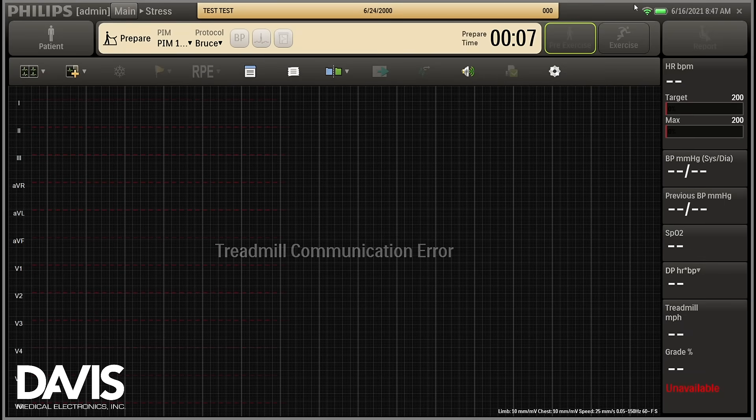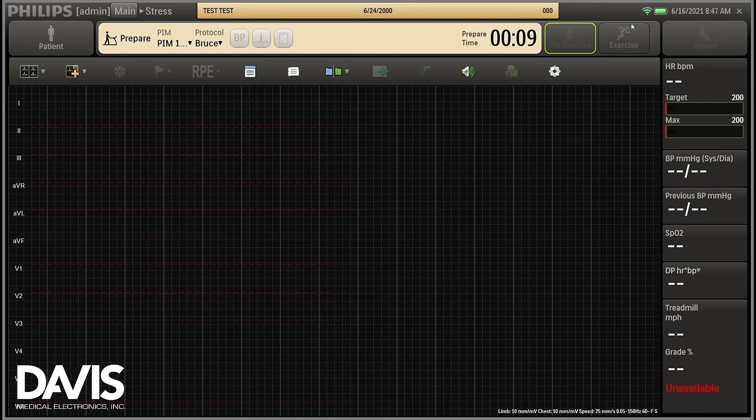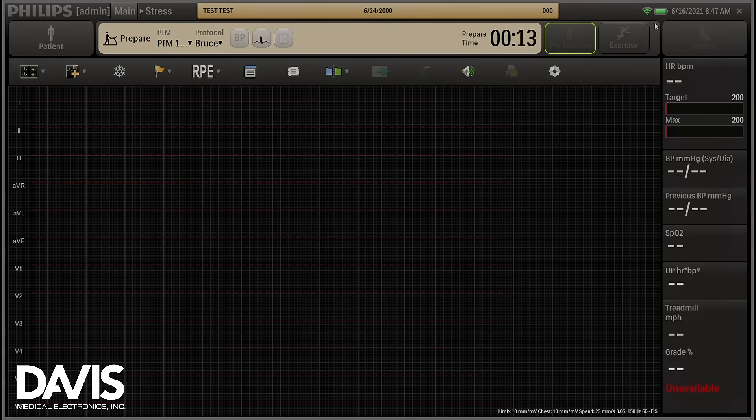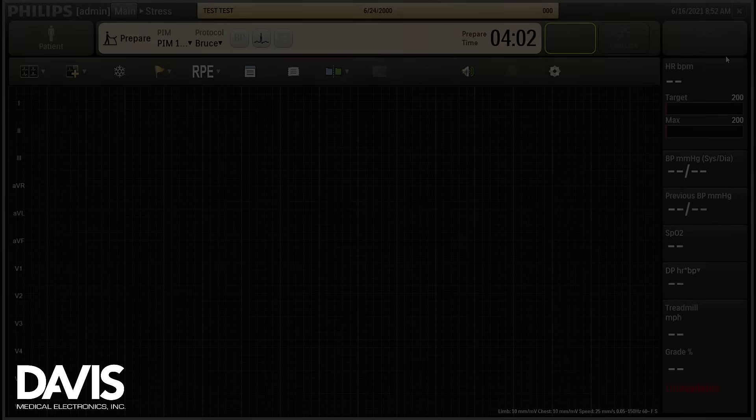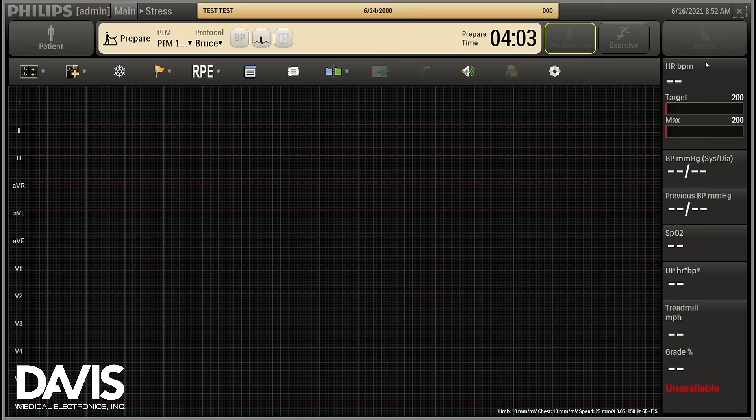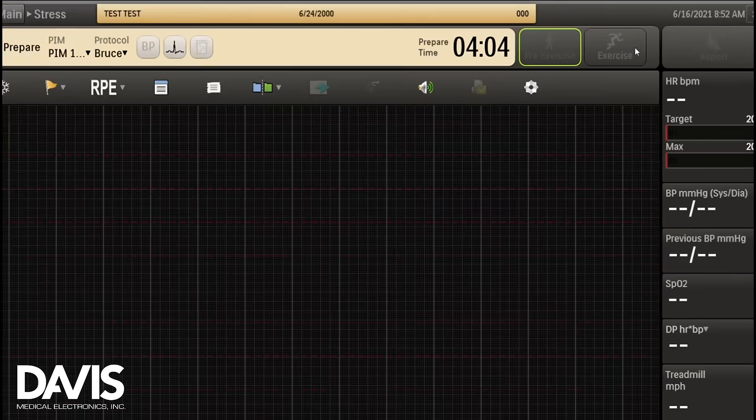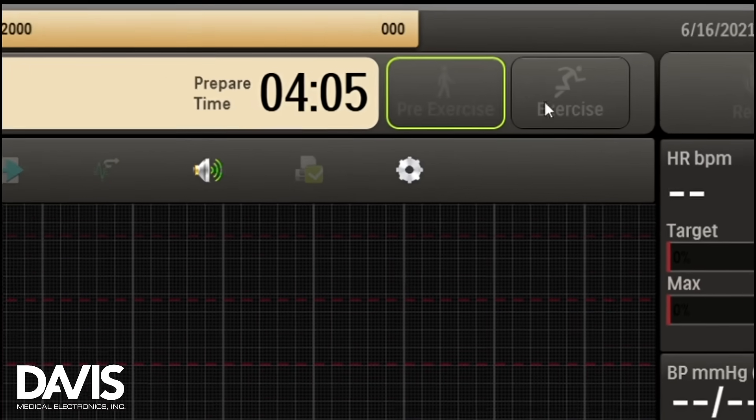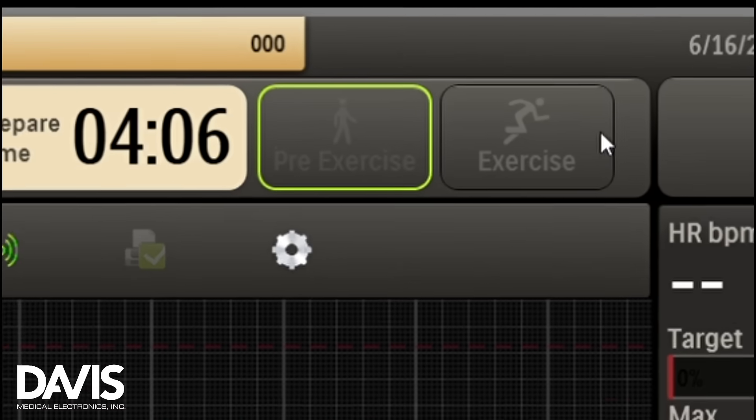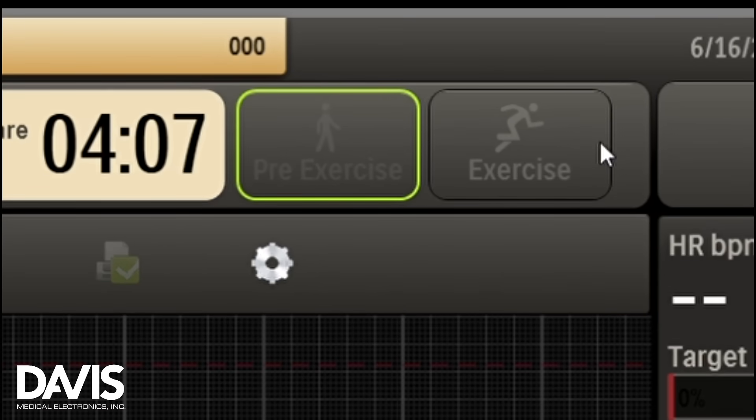Verify that the signal indicator and battery icon are present. This indicates that the PIM module is communicating with the system. If you do not see these icons, ensure that your PIM module is powered on.